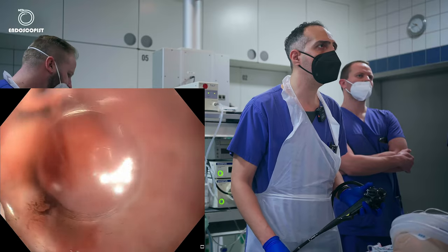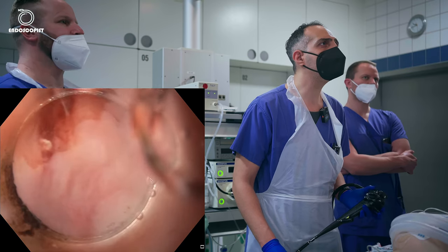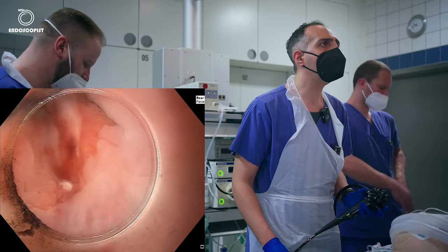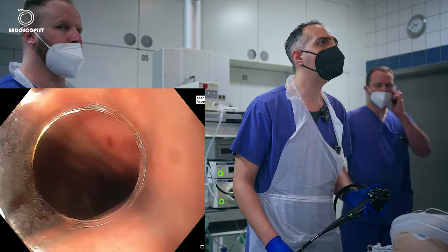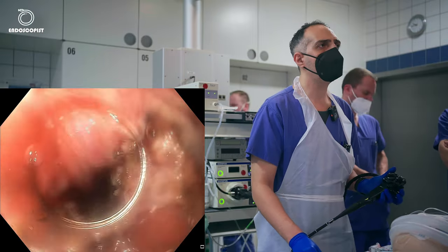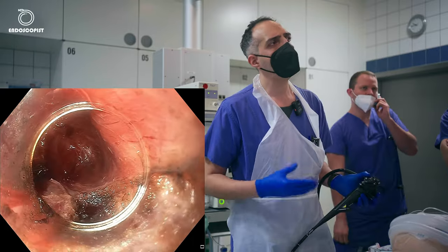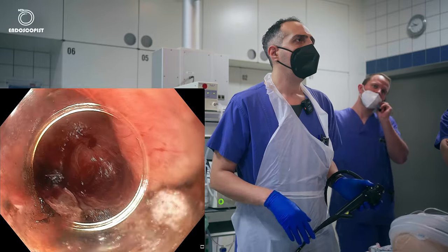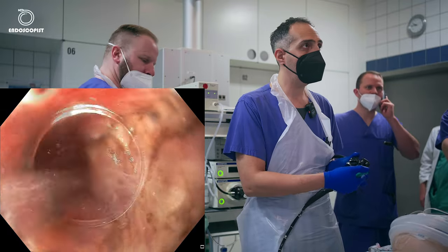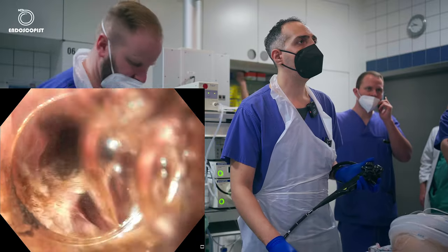I check the mucosa here to see if there is any perforation. There is no perforation. It looks fine as well. So at the end of our myotomy, we usually wash the tunnel with gentamicin. There is no evidence for that, but that's the way we do it. Okay. So we'll inject now the gentamicin with some normal saline.